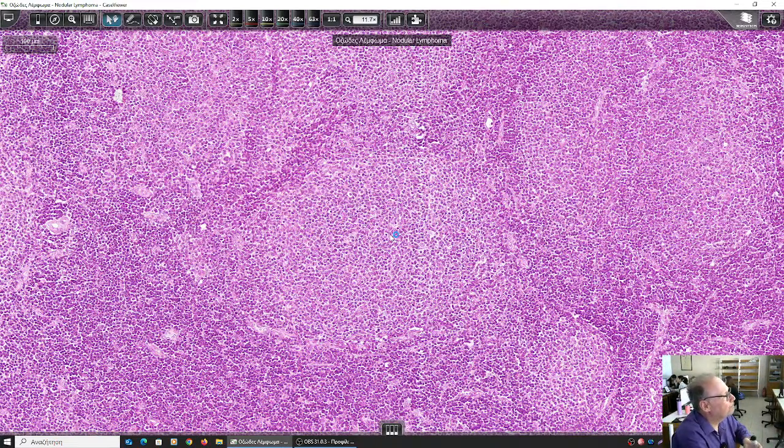Yes, please. Louder please. They look all the same. They are monotonous. So, do you see those cells having the apoptotic bodies that we said they had in reactive lymph nodes, where there was increased proliferation and apoptosis, and we had some macrophages phagocytosing the apoptotic remnants?